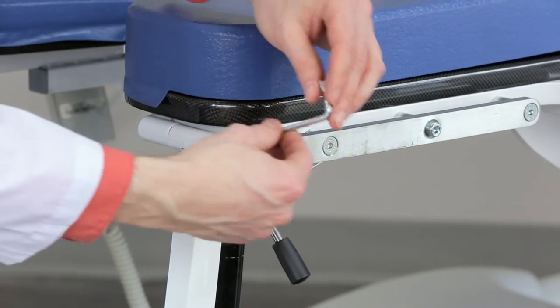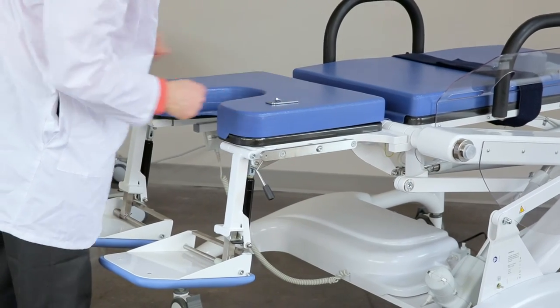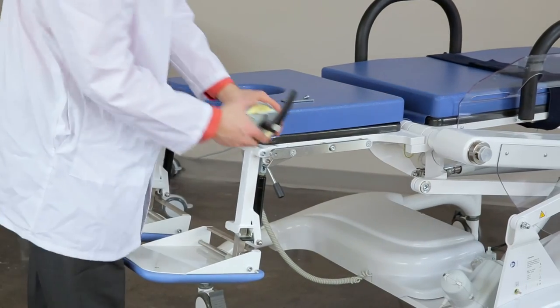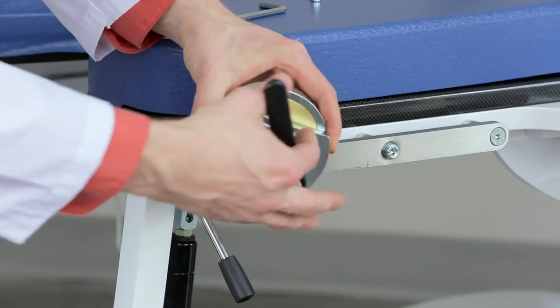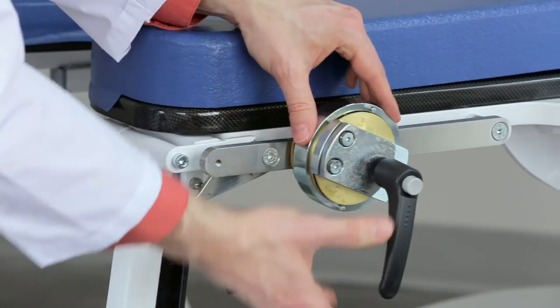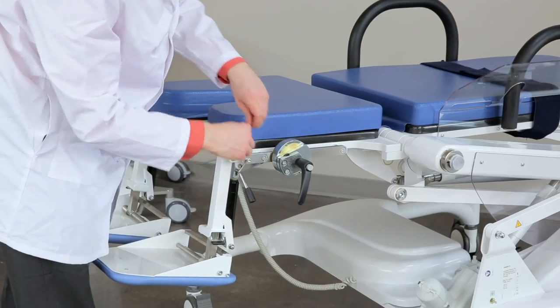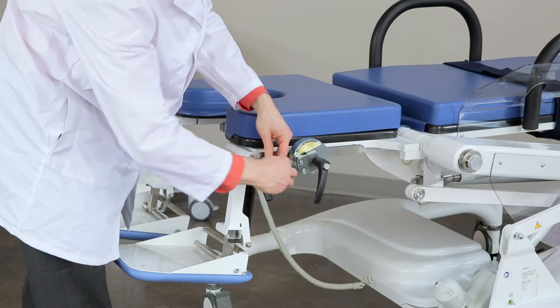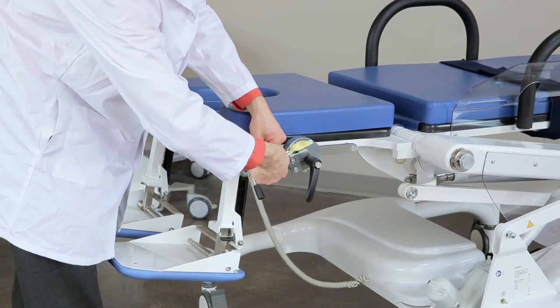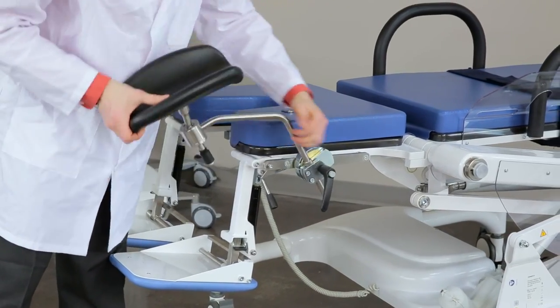Unscrew the locking bolts at the front of the rails underneath the sides of the seat with a five millimeter allen key. Rotate the handle on the leg rest holder counterclockwise to loosen and slide it onto the track. Then replace the lock on the track with the allen key. Insert the leg rest into the holder and adjust the height and angle to your preference.